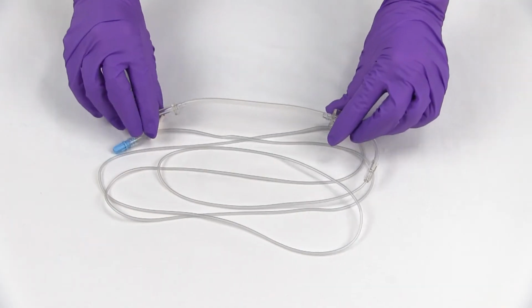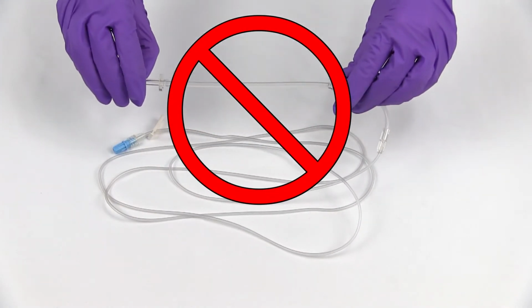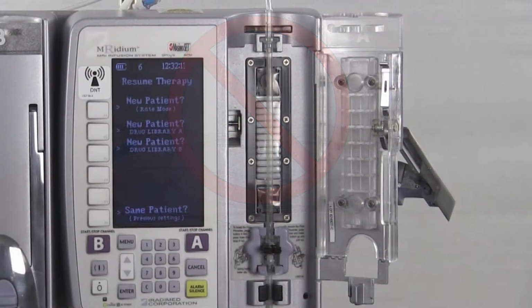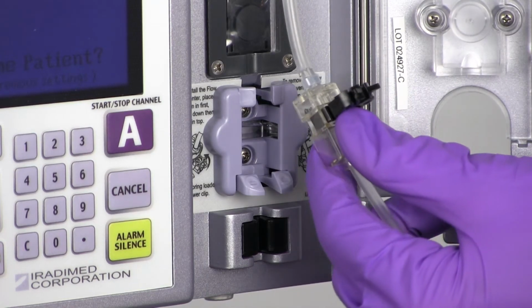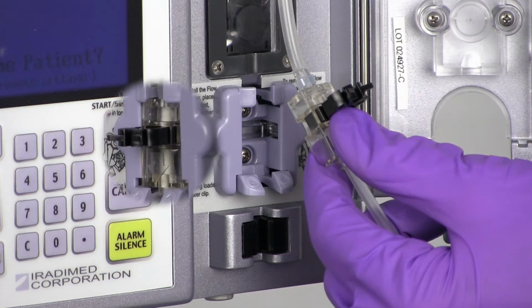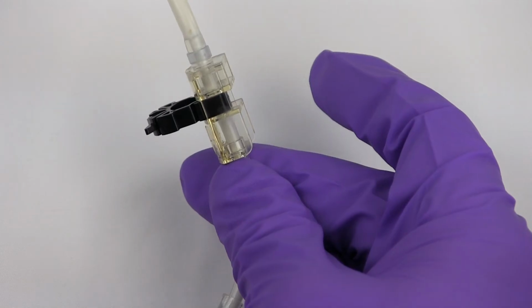Be sure to take care when handling the IV sets that the user does not stretch the IV set's silicone tubing which loads into the pump's chamber. Stretching this section of tubing may prevent it from aligning properly along the peristaltic rollers and may cause an inaccurate flow rate. The user will then firmly grasp the flow preventer by placing their thumb on top of the clear arrow on the flow preventer clamp. Ensure the clamp is pulled completely out to the closed position.